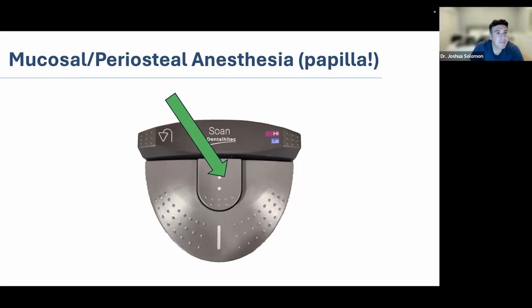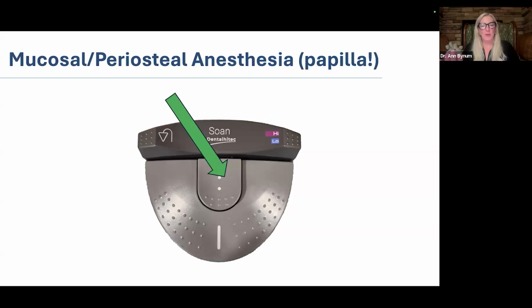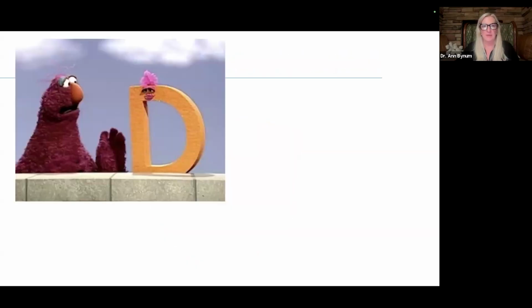I've never noticed that. You taught me something new. Thank you. Yes. And also, if you're a size 10 shoe and you're laying your big whopping foot on there and you happen to touch that outer pedal, the device is always going to default to the inner little tiny pedal there. So you don't have to worry about that.